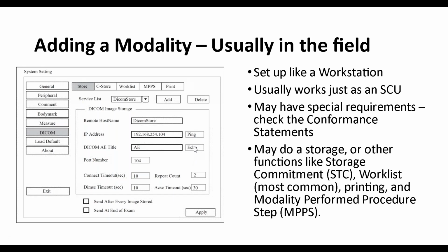And notice here you got ping and echo. Notice ping is on IP, but echo is on DICOM AE title. What do they mean by the differences between ping and echo? It's close. Let me put it this way: ping, IP, just like the IP ping command at command prompt. Echo, remember when we did an echo, we did the test successful? Echo is actually that DICOM validation. Remember the C-echo command, right? And notice this is the port number of this remote. And so this is how they set things up.